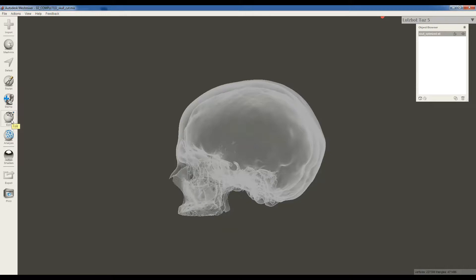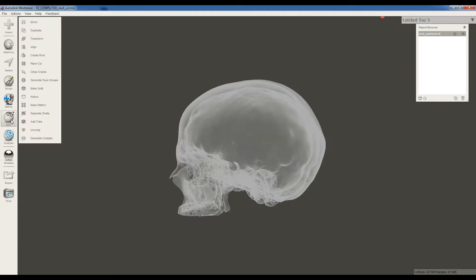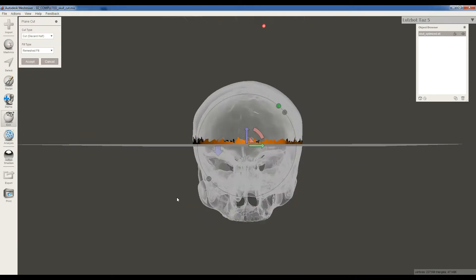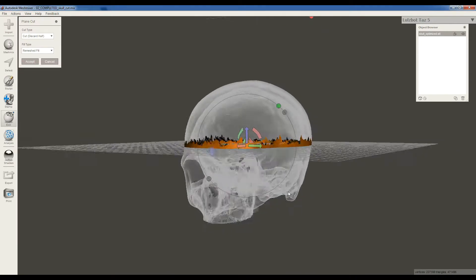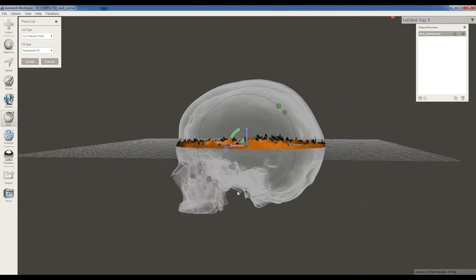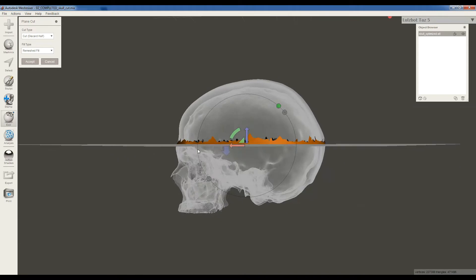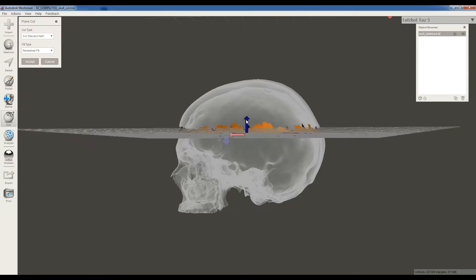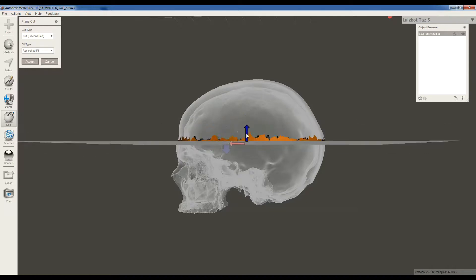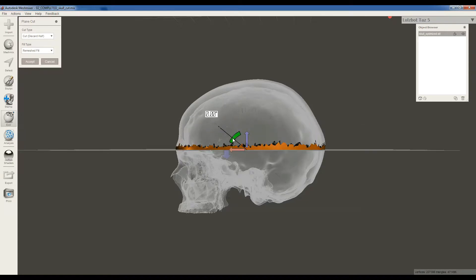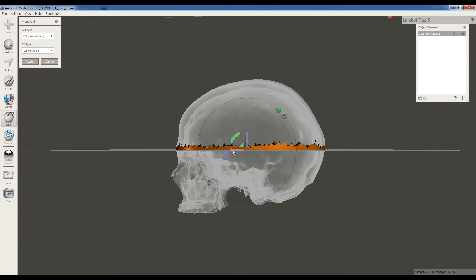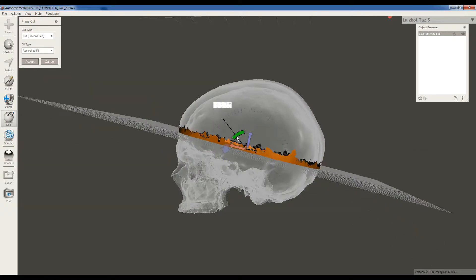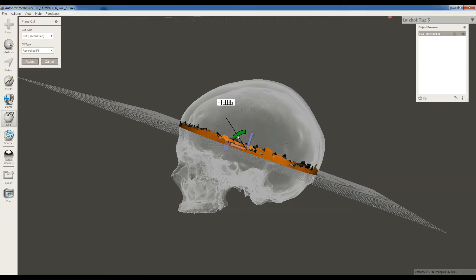The next step is to start cutting it. We're going to go to Edit Plane Cut. You can see here it's actually left to right, it's aligned pretty well, but we want to line it up with this trajectory. You can see here that I can move the plane up and down by dragging the arrows that point in a certain direction. So I'm going to take this green arrow, which is going to move in both the, so red, green, blue, X, Y, Z. It's going to move in the X and Z planes, red and blue planes. All right, so that's about lined up.